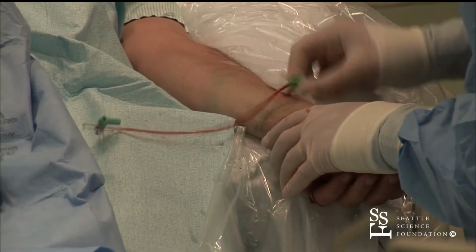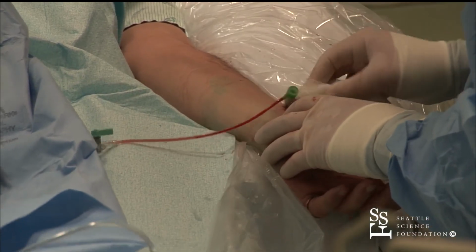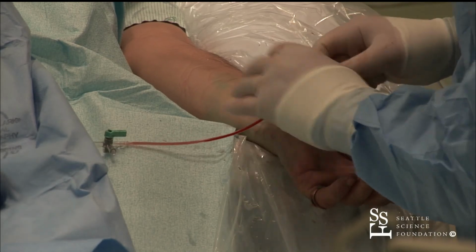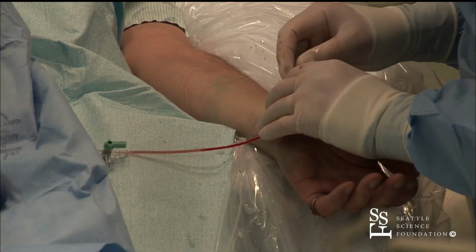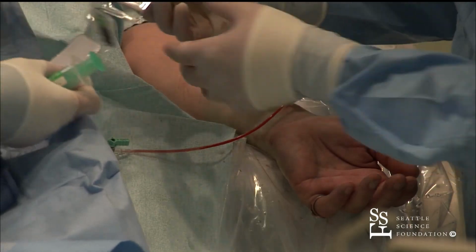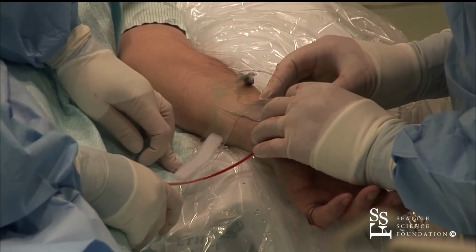I think if you're having to do the whole case by yourself, remember how we got trained to do that? Yeah. If that were the case, I probably would do it because the coating, I agree with you, does make the thing come out. But usually I've got somebody scrubbed in holding the wire and everything. We just got used to it, and now the techs like it, the fellows like it, so it's become standard. I was the last one to like it, but I use it. I do it on the right wrist because again, it sticks it down.